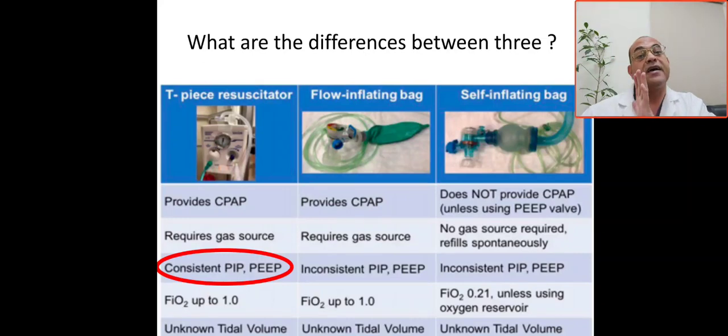And also I need PIP. PIP is constant also. So it will prevent swinging in the pressure leading to shearing injuries and barotrauma. So the controllable and constant standing pressure will help to prevent the barotrauma.